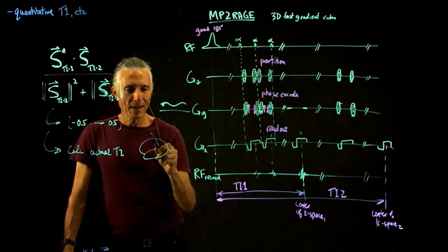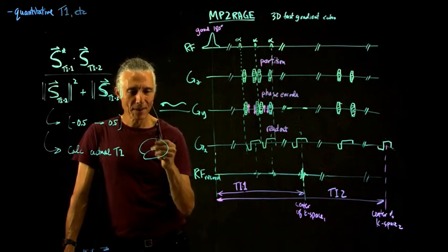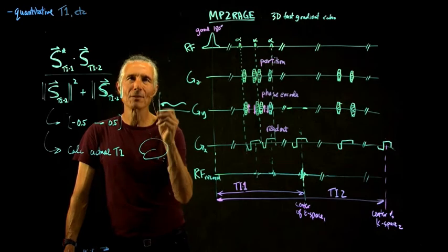But out in the air it just looks like complete noise. And not only that, the skull looks like complete noise.